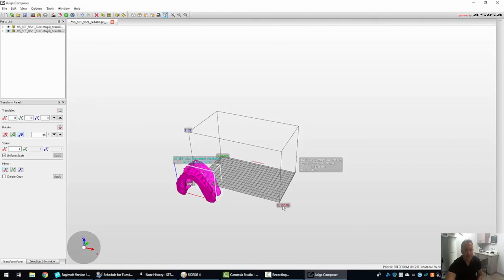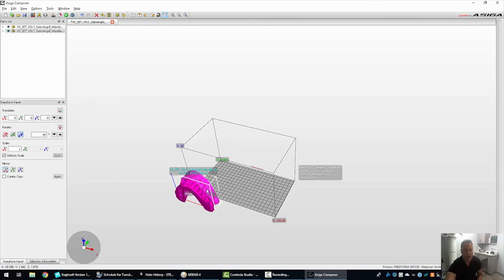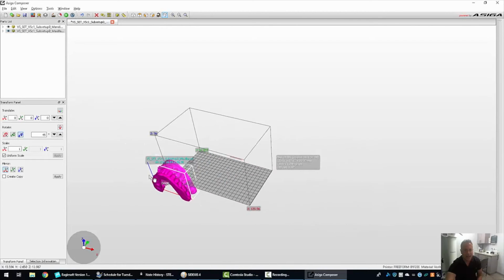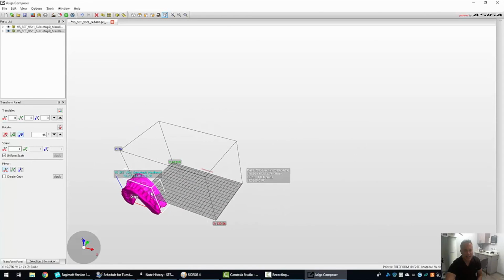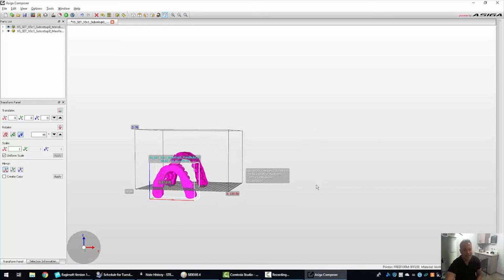So what you do is you click it and you get a bounding box. If you just left click, the mouse kind of moves like this. But if you hold the button down till the mouse becomes blue, you can now move the model over. So again, mouse becomes blue and move it over. Again, this is sort of a redundant step.